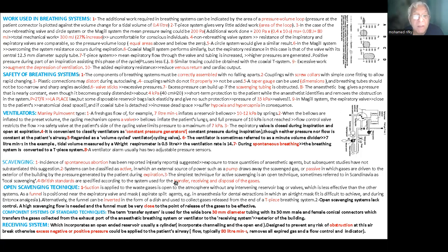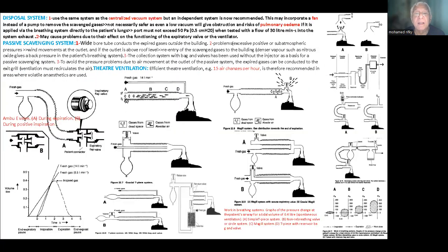We'll show some figures later on instead of talking much about the system. Of course, as we saw, it can be passive or active. And the active has components. These components are made of 3 parts, as you can see from the figure.